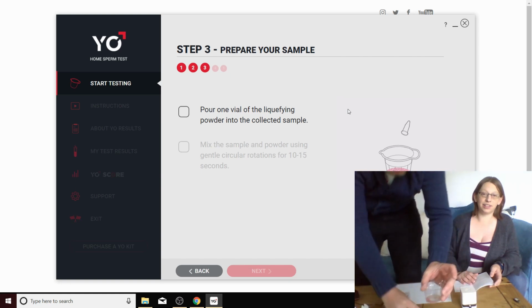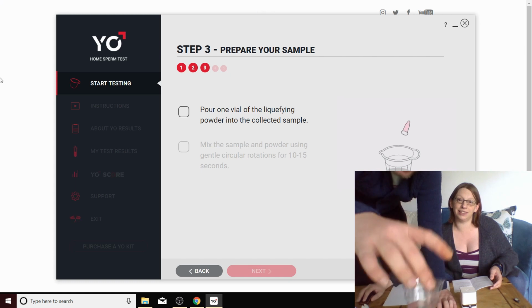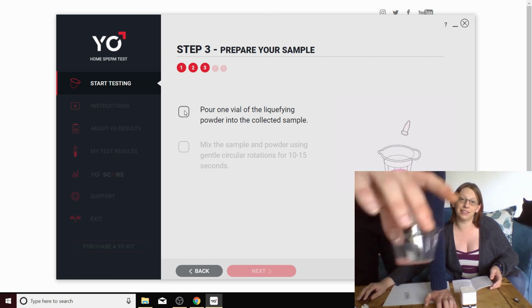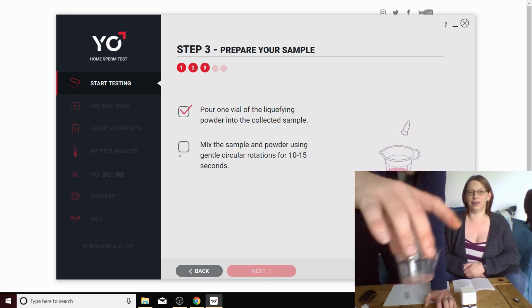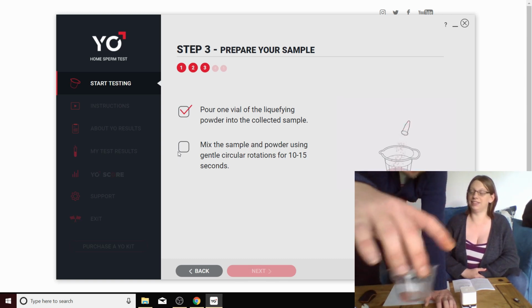And then, I've got to rotate it for 10 to 15 seconds. And in fact, I don't know if you can see that on camera, but it's gone much runnier already and a beautiful shade of cherryade pink. Yeah. So gentle circular motion for 10 to 15 seconds.